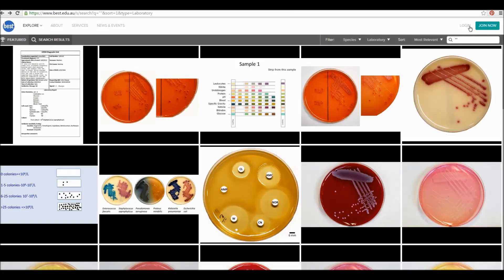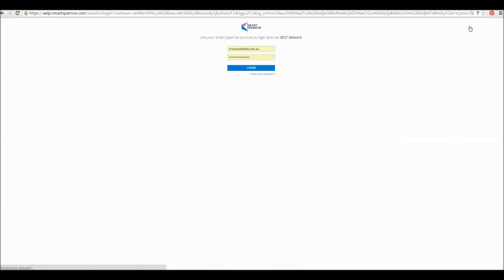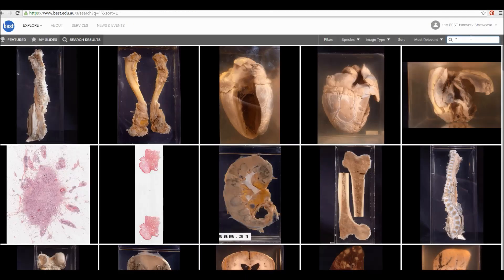To start annotating, make sure you're logged into your Slice account so that all of the Slice tools are available to you. Once logged in, use the search bar to find an image relevant to your studies.